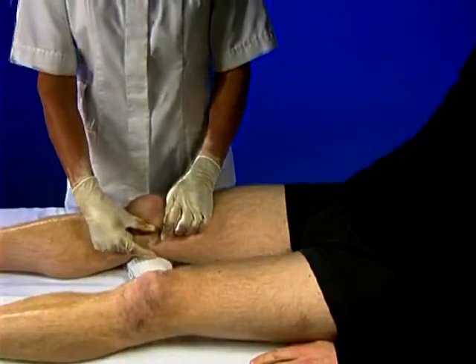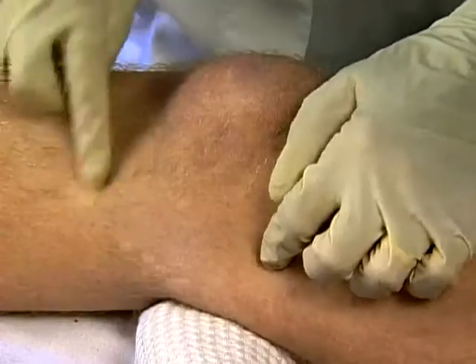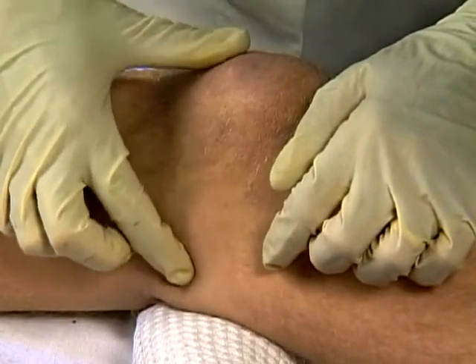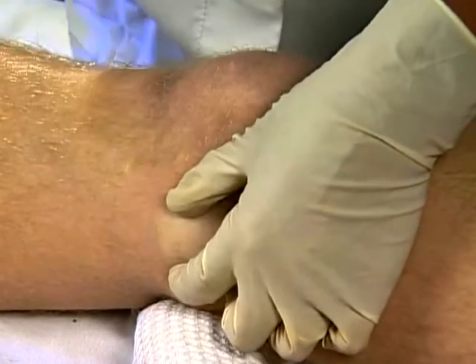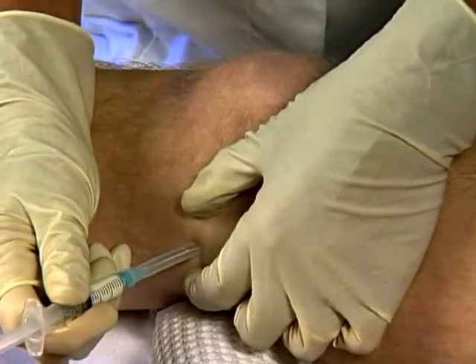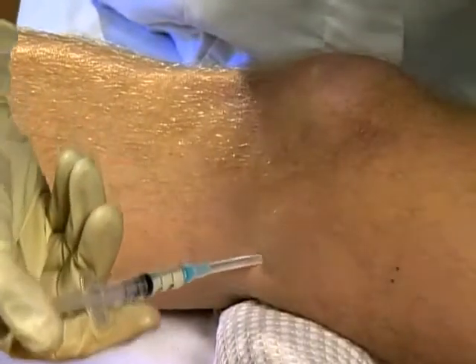The medial collateral ligament runs in a broad band from above the medial condyle, inserting low down on the tibia. It is usually affected along the joint line. Mark the entry point at the tender area, clean and firmly stretch skin, and rapidly insert needle perpendicularly. Aspirate and pepper into the ligament, taking care not to enter the joint space.